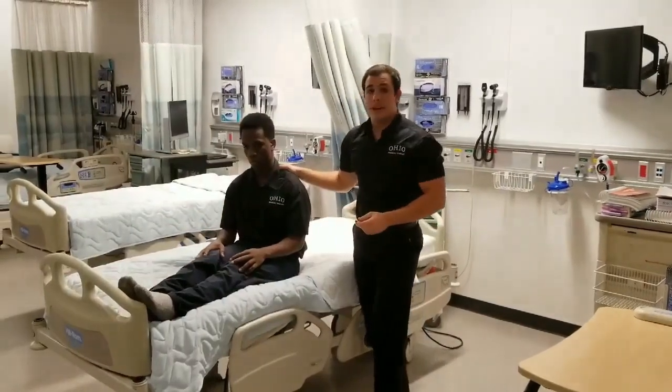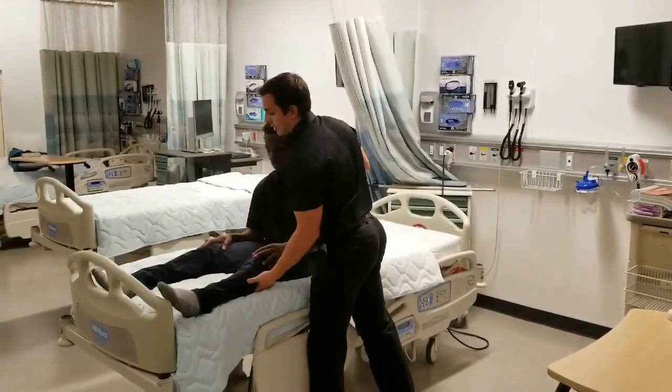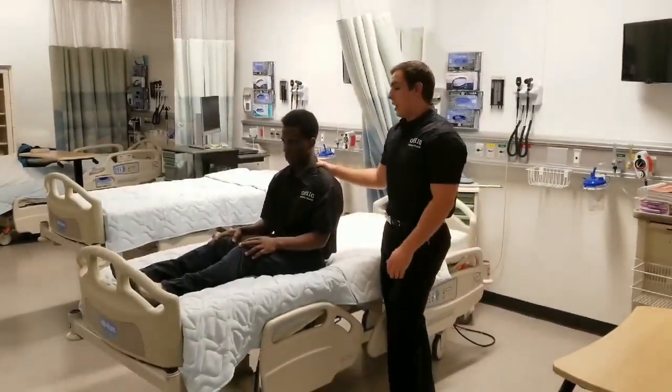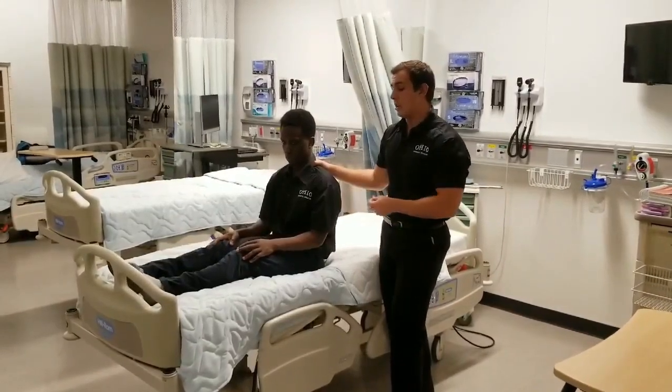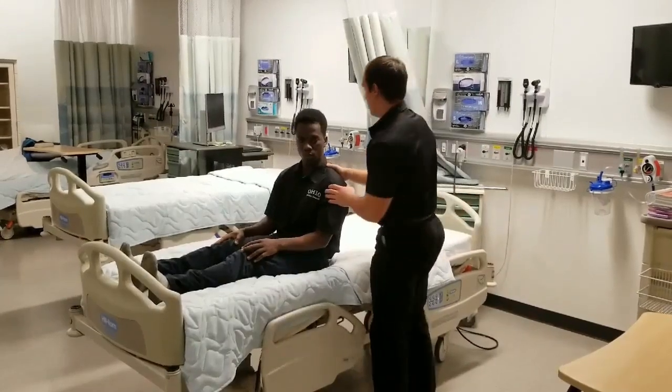Once their legs are on the bed, you'll want to abduct and adduct the legs until he is centered in the bed again. At this point, he's in the long sitting position once again, and we'll just lower him gently to the supine position. We'll lower you down, okay?